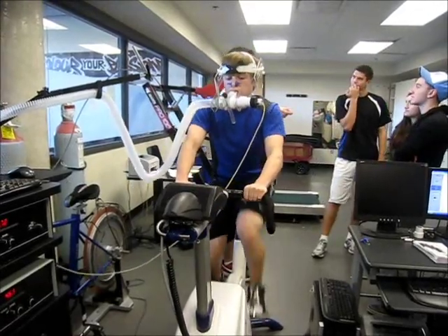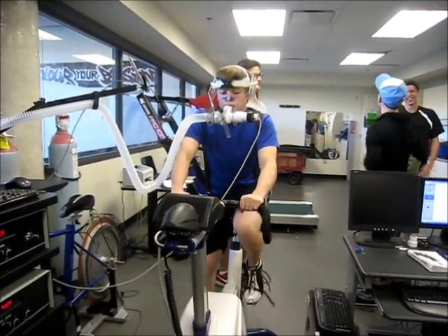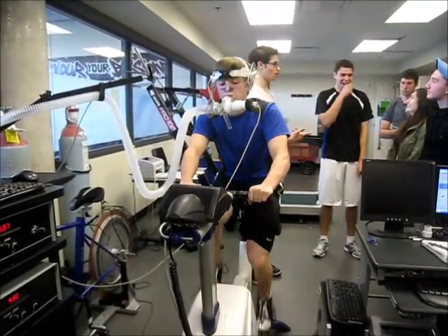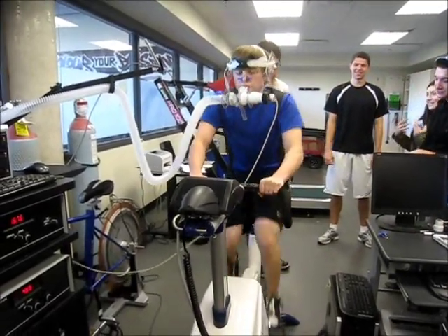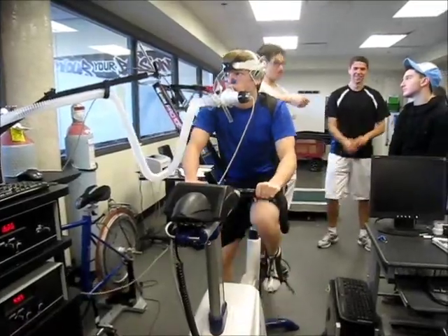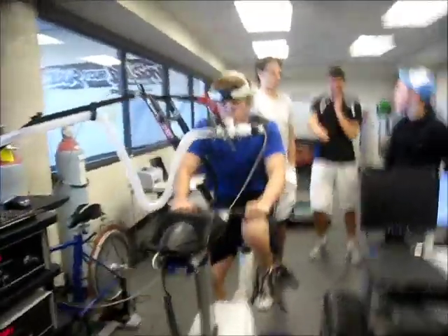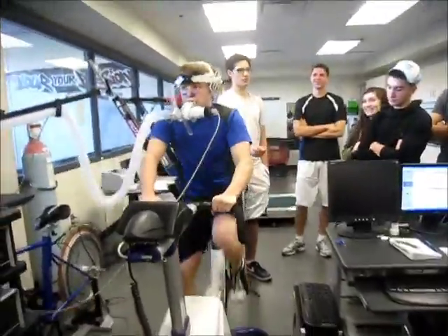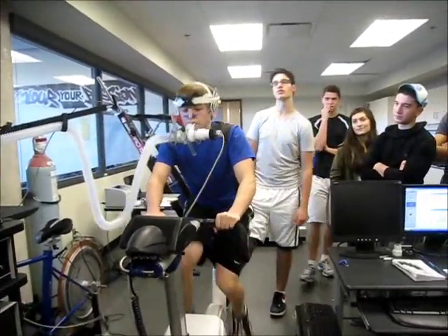Is the watt-to-second ratio for ease of participants? Yes. You want it to be something that they'll finish between 8 and 12 minutes. If it was one watt every second, the test would be done too soon and wouldn't give a real indication. So it's calibrated to make sure they'll finish it out. Let's go Daniel! His VO2 is around 45 — he's doing awesome, almost at that 50 mark, which is great.